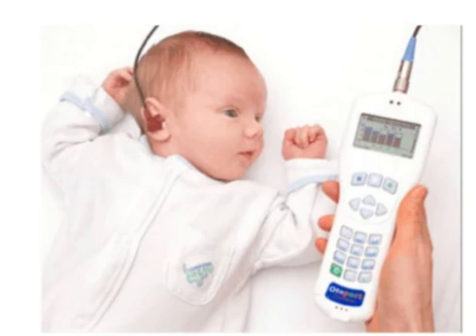Tinnitus. Tinnitus is an abnormal perception of sound in the absence of external stimuli associated with disorders of the auditory system. Studies show that DPOAE amplitudes are consistently reduced in patients with tinnitus than patients without tinnitus, even in those with normal hearing on audiograms.